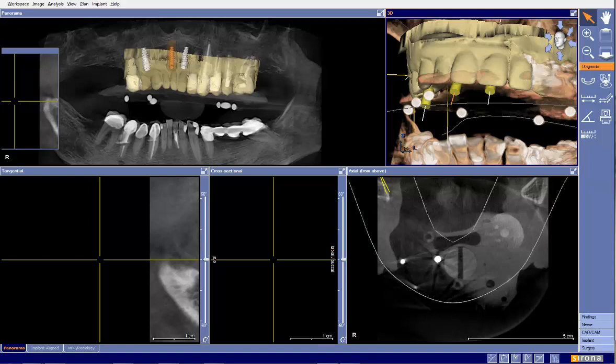The history is patient had existing partial and then needed tooth number 6 taken out. It was extracted. What the notes say was traumatically. I don't know if they meant to say atraumatically, and it was grafted at that time, approximately 4 months ago. So based on the grafting comment, I'll assume that it was maybe traumatically taken out, maybe some buccal bone was lost or something. The patient is now interested in a few implants, 2 implants, to help retain her partial.